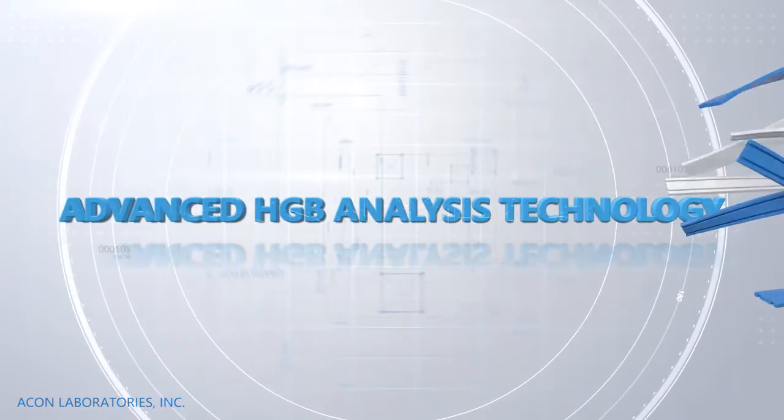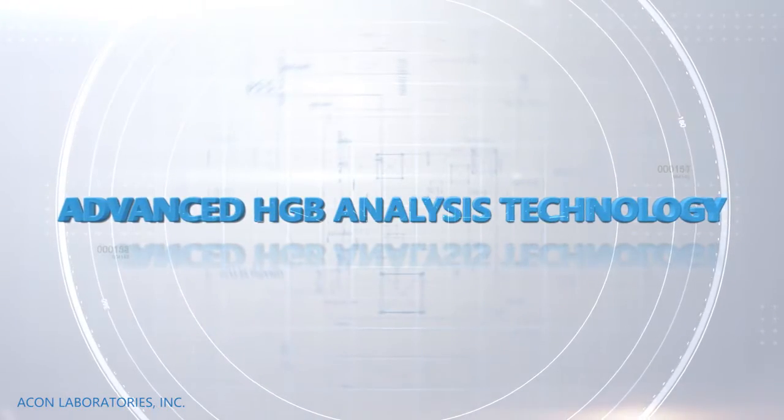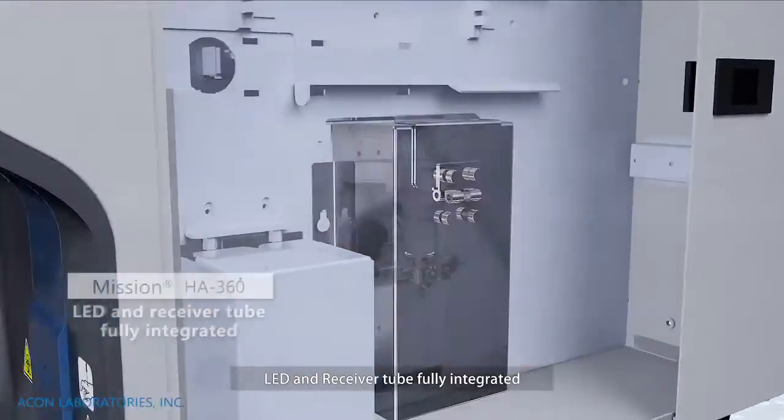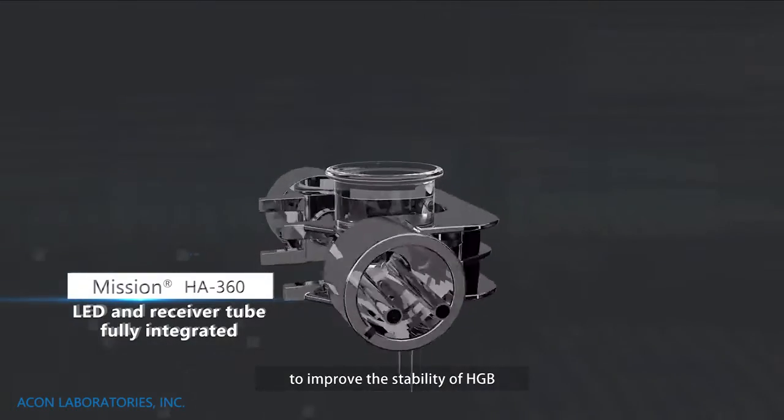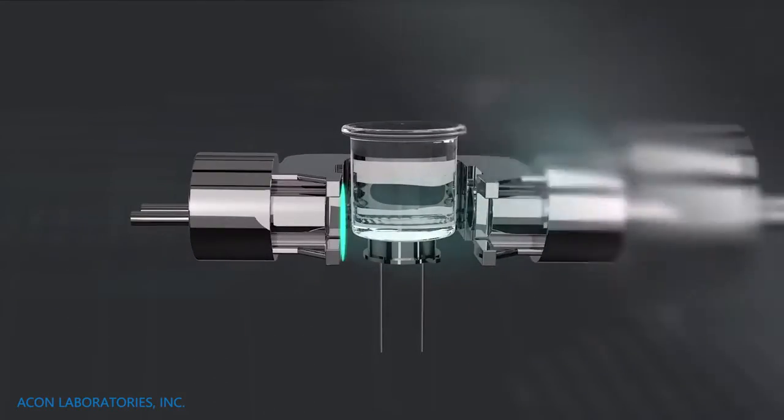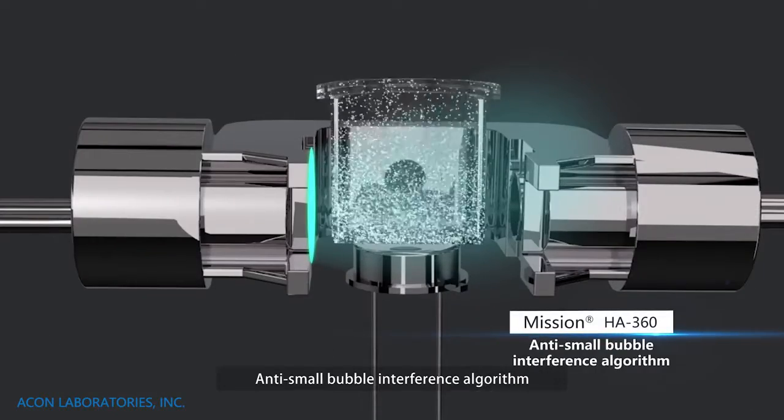Advanced HGB analysis technology. LED and receiver tubes are fully integrated to improve the stability of HGB. Anti-small bubble interference algorithm included.